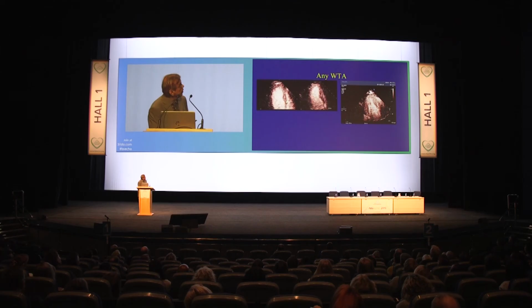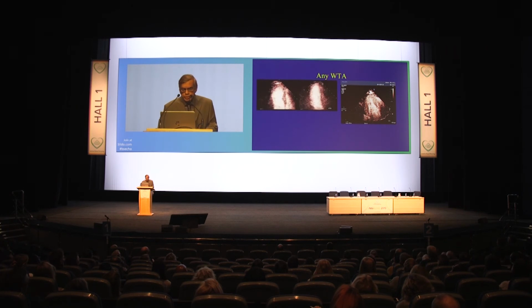Now this is another example of another patient, rest and stress. Now I'm not sure what's happening here. Is there wall motion abnormality? It looks like it, but look at the perfusion image here. The same patient, perfusion, flash. So flash comes in, and look at how it fills up very quickly, completely. So we called it normal.